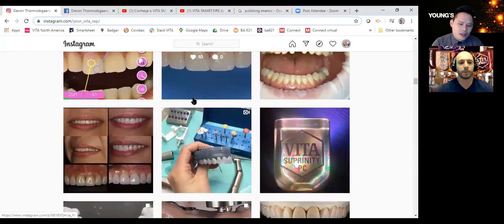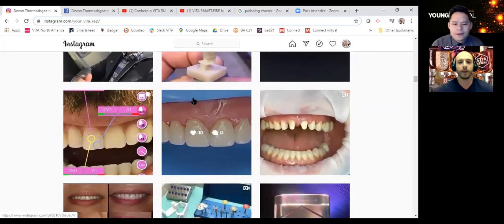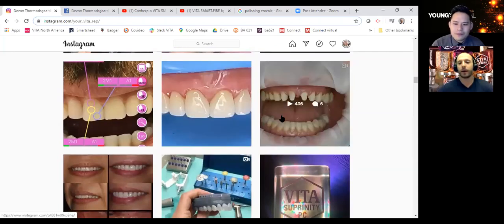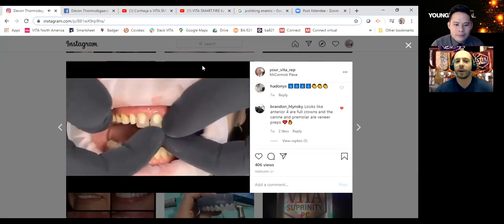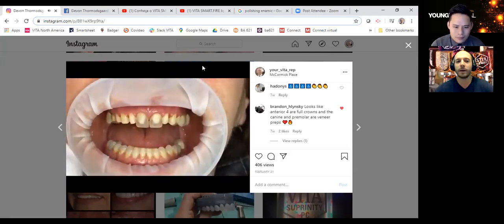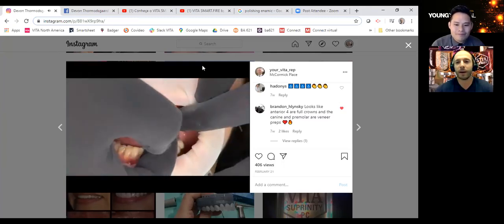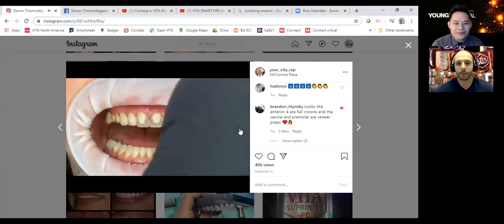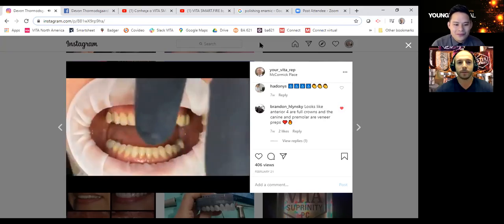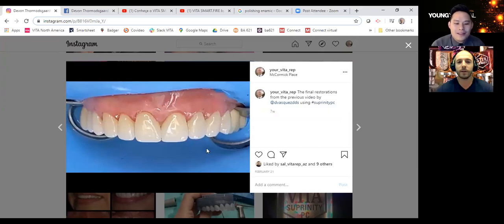Should we move on to maybe another material? Let's go and show everyone what material you're using for each picture. Let's talk about Suprinity because a lot of people want a high strength material. This is an eight-unit case from Daniel Vasquez in Oceanside. What's really cool about Suprinity is you try it in clear — we can see how it fits on the prep and on the margin. These two are crowns and everything else is like a three-quarter crown slash veneer. We can see them trying them in and get an idea of how the shape's going to look. Here's the finished result — beautiful.